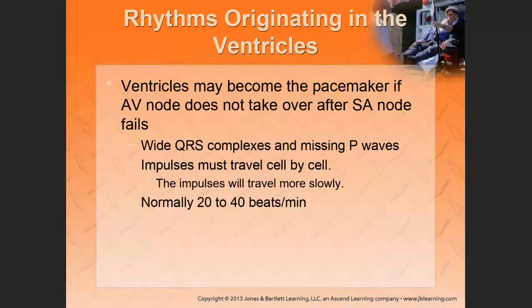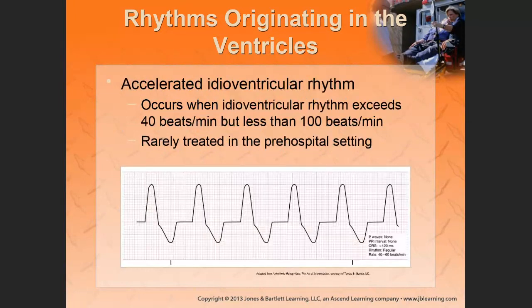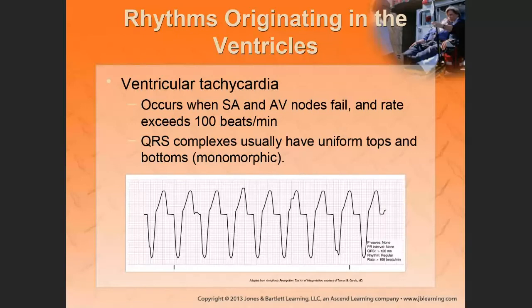All right. Ventricular rhythms. The ones I'm going to show you now, you need to know. And there's something that is very unique. This is the first one I'm going to show you. Does it look pretty or ugly?